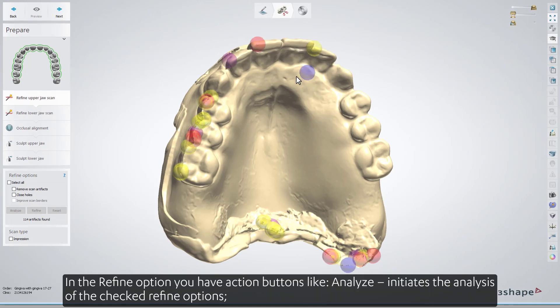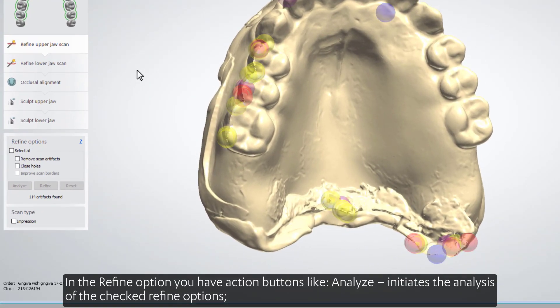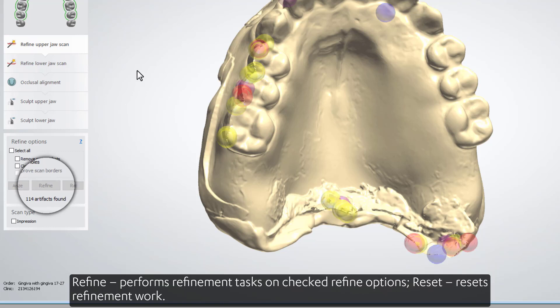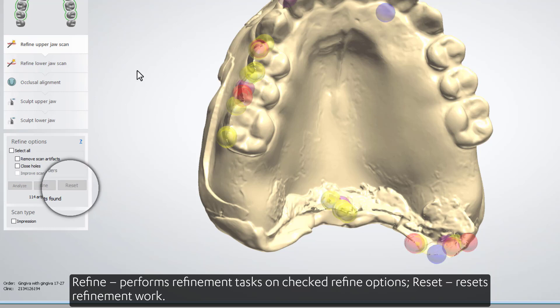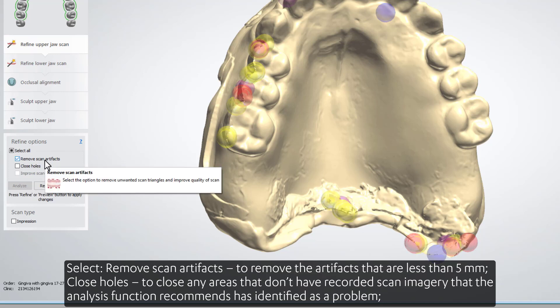In the Refine option, you have action buttons. Analyze initiates the analysis of the checked Refine options. Refine performs refinement tasks on the checked Refine options. Reset resets refinement work. Select Remove Scan Artifacts to remove artifacts that are less than 5 mm.